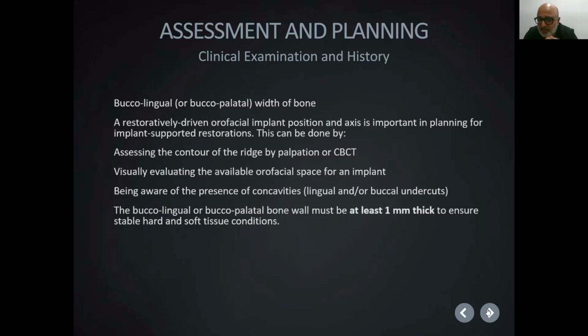Which you can do by palpation, but nobody does that anymore. My recommendation, I am going to go through old school, because not everybody has access to CBCT or has one in their practice, or sometimes it can be quite difficult sending the patient to go and have one. They don't want to pay for one, etc. They may not be motivated at that point. So there are other ways of doing it, and I'll talk about that in a moment.